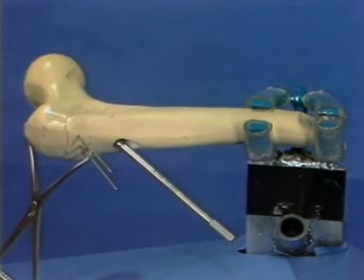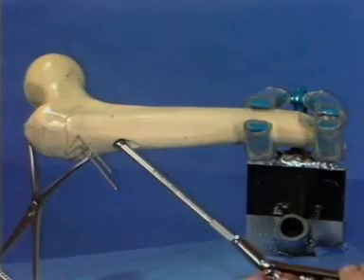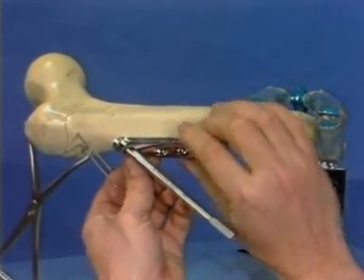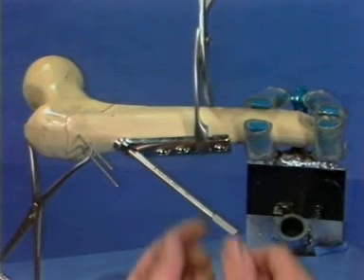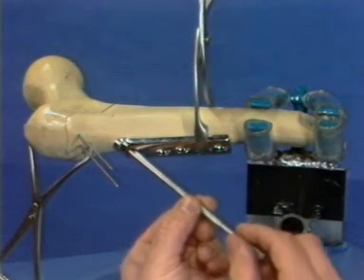We remove the centering sleeve and the DHS wrench. From the DHS plate selection, a 4-hole, 135-degree plate is chosen and placed over the guide pin and DHS screw and temporarily held in place with a self-centering bone-holding forceps. Subsequently, the coupling screw is loosened and the guide shaft assembly is removed.